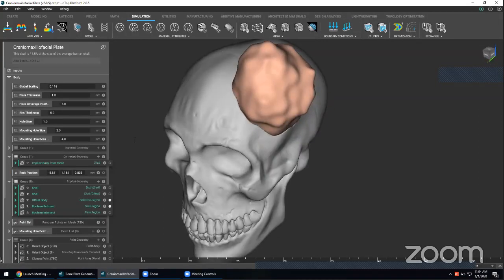Now, normally each patient-specific solution requires a lot of manual data processing, some very specific implant modeling, and a lot of labor to ensure conformity. And we've been told by quite a few companies and design firms that a custom implant can take a very long time to design, and it can be an operational bottleneck when trying to determine what the right approach is to provide the best patient outcome in each situation.